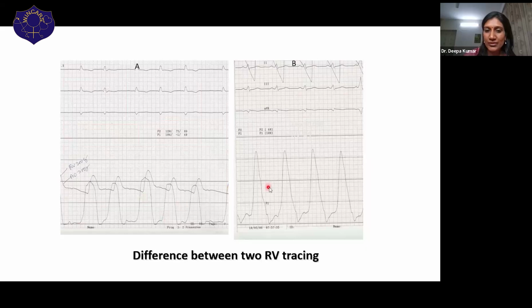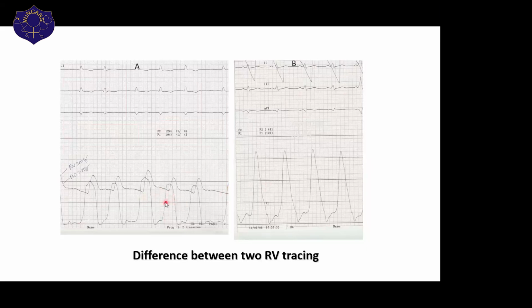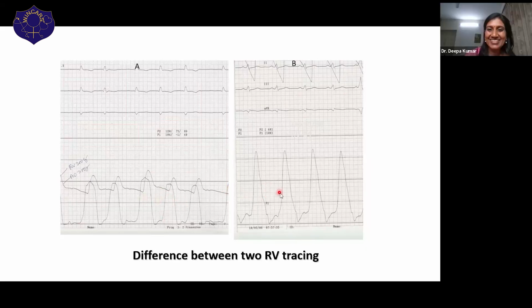Anand, shall I go forward? They just wrote that in the second one, a sharp peak is seen. So yes. Okay, that is the morphology, the characteristic of the wave. That is what I wanted you to notice.